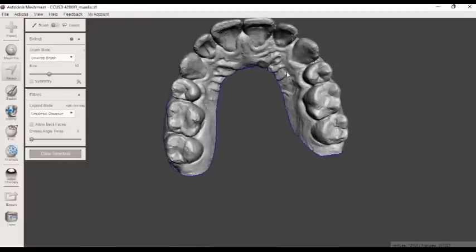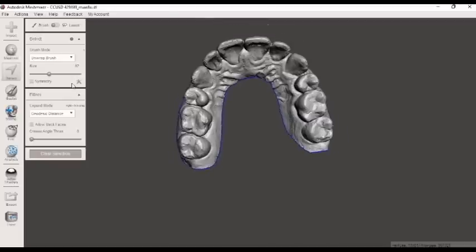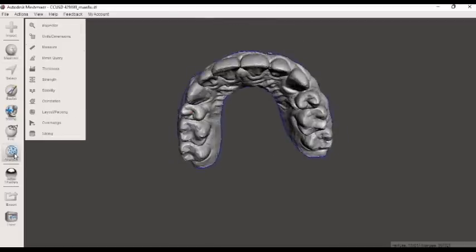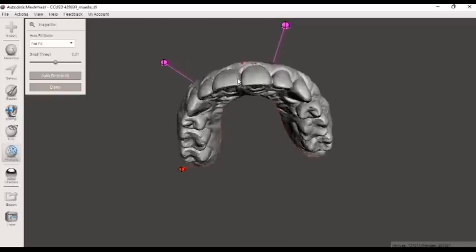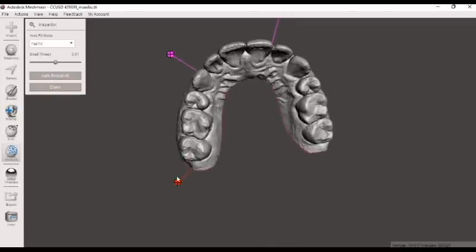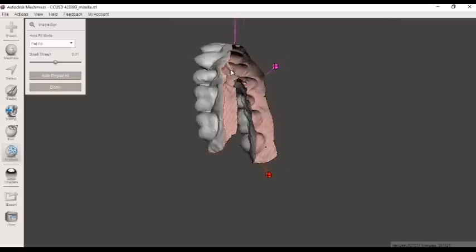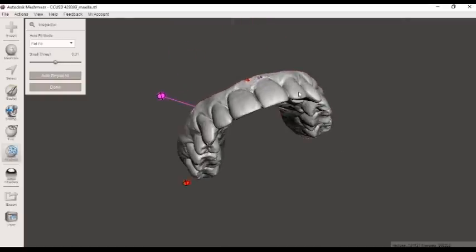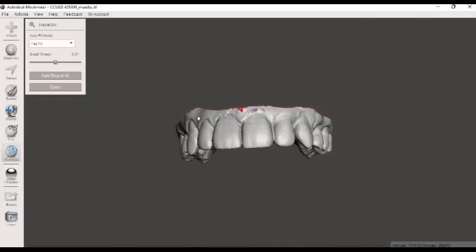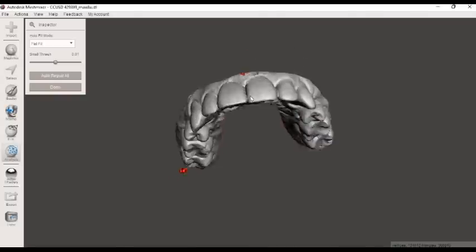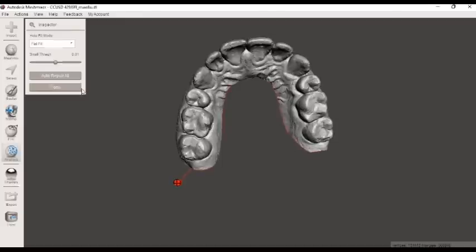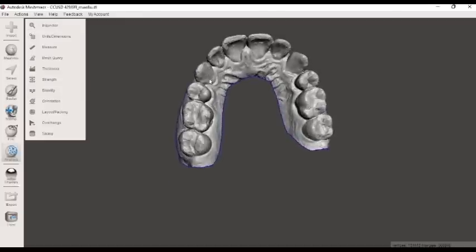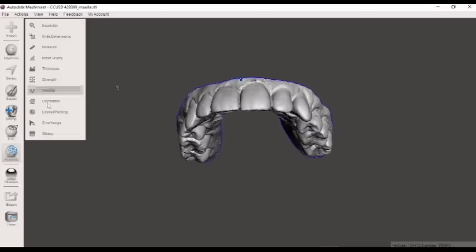So before we extrude the model, I am going to choose our inspector key again, make sure we got all the holes filled. So there's our red boundary that we were talking about earlier. I am not selecting that. But these purple ones usually indicate some kind of floater. So let's get rid of the floater.